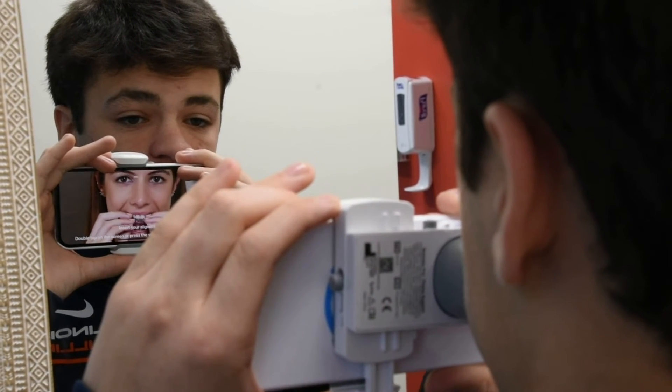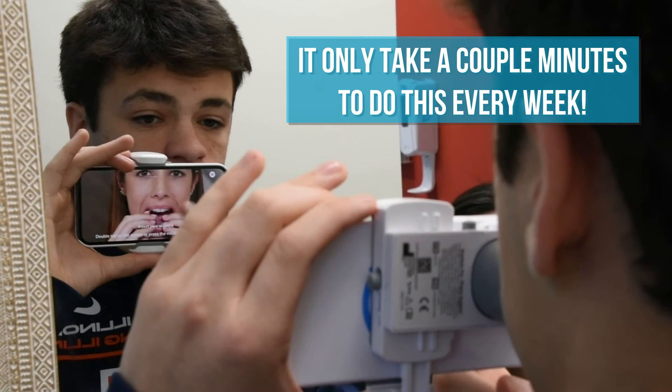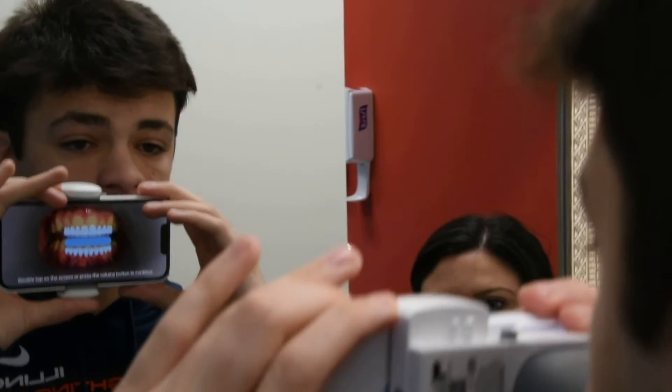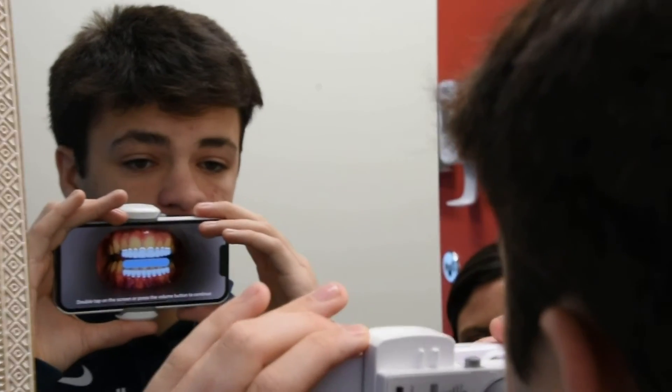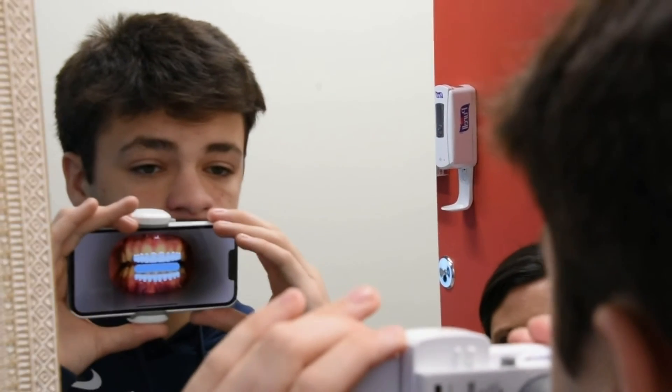Insert your aligners. Double tap to continue. Next step: keep your teeth slightly apart and scan side to side. Double tap to continue. Open your mouth slightly and keep your teeth apart.